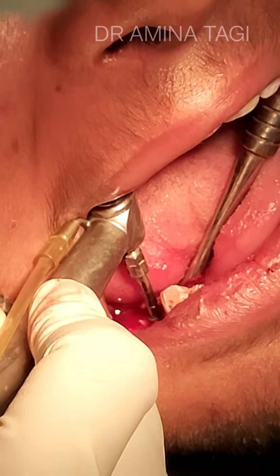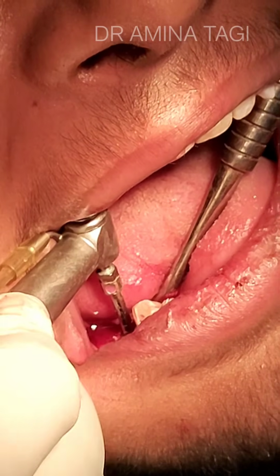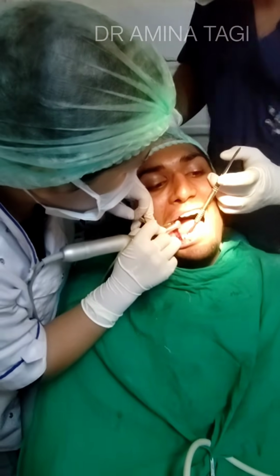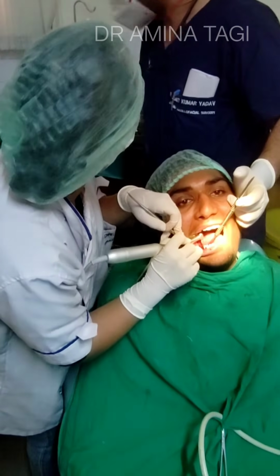So now as I'm inserting the implant, I can feel the torque. So you can see that I'm asking my assistant to increase the torque. We are increasing the torque till 60 NCM.